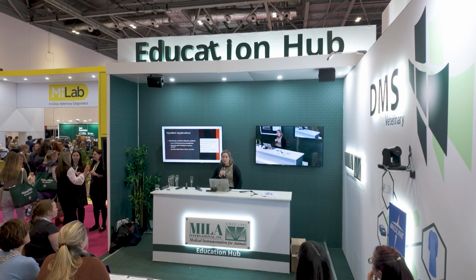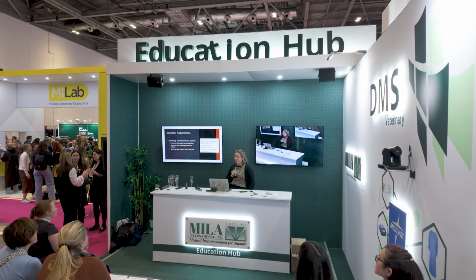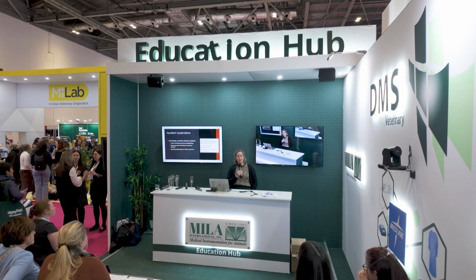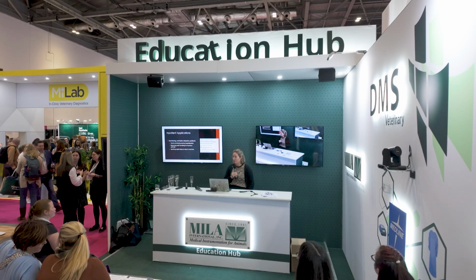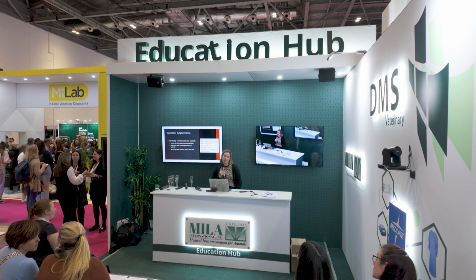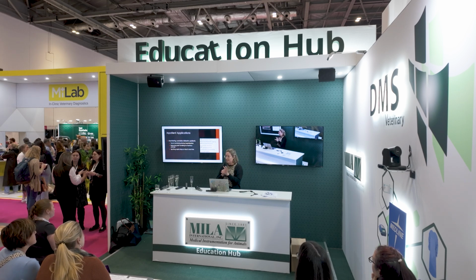In terms of anaesthesia and surgery, we do quite a lot of eye surgery in the hospital where we work, and a lot of diabetic cataract surgery. So we would put one of these on the day or two before surgery, or get the owner even, in this case, to put them on. Then that patient can come in, and we've got a really good way of measuring their blood glucose in and around that surgery time, hospitalization itself.